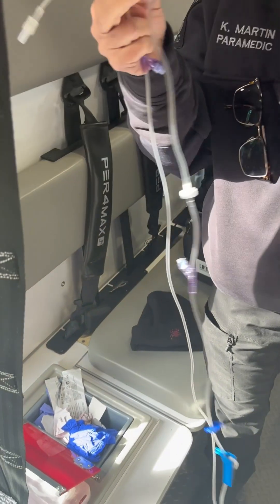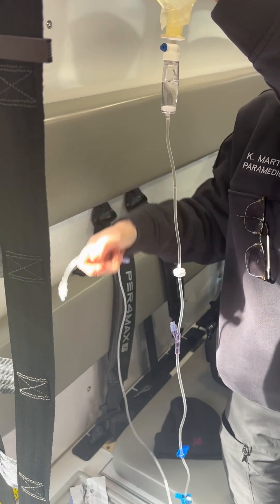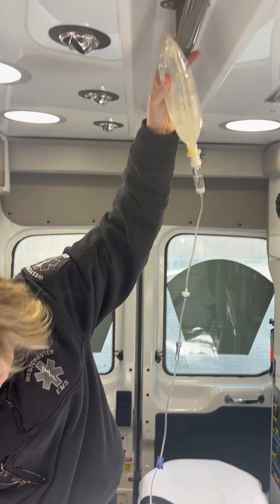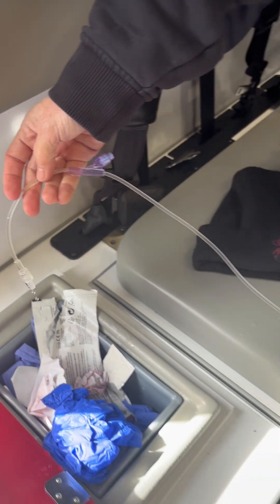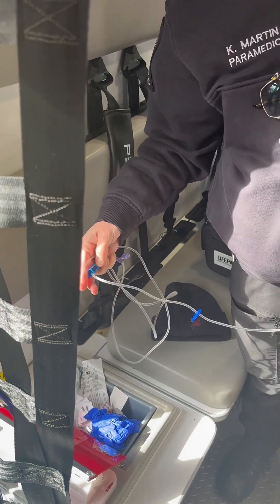Now the fluid is going to flow — you've got to fill this little chamber up here halfway and let that go. Then you can hang this up and see how it's dripping. See all those bubbles in the tube? We're going to get the bubbles out. And now the bubbles are basically out — so this is locked, loaded, and ready to go.